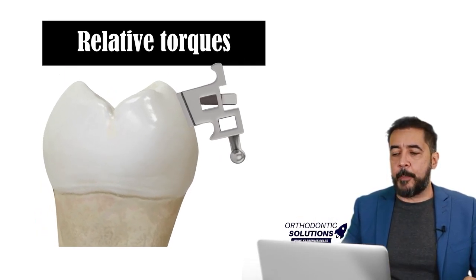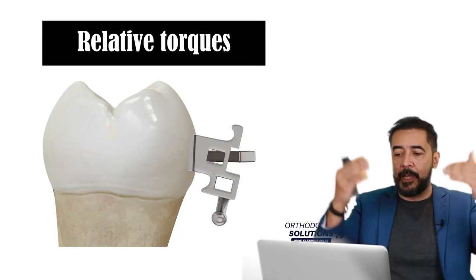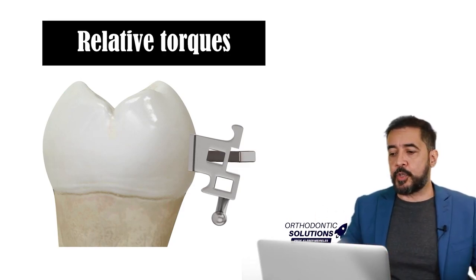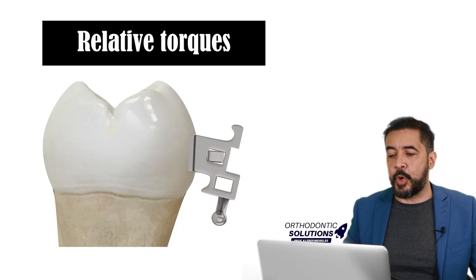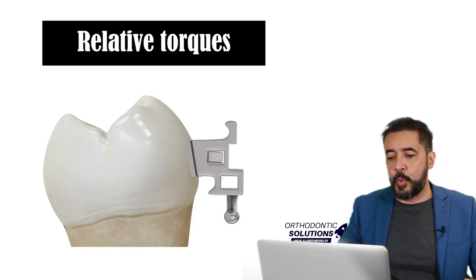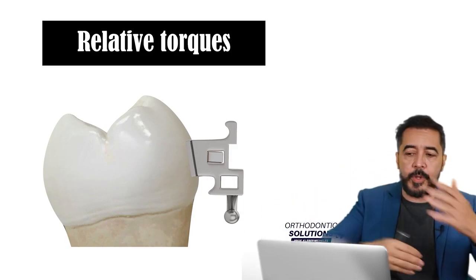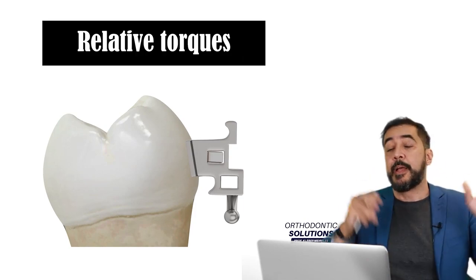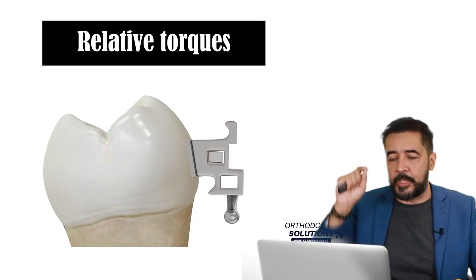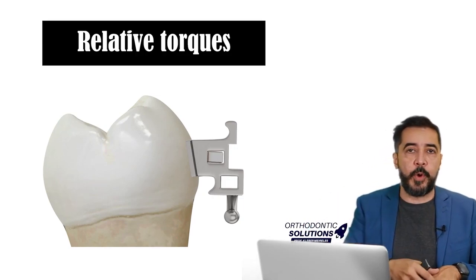And when you do the opposite, when you go downwards, apically, with the positioning of this tube, what is going to happen? Quite the opposite. You get a negative crown torque, meaning the crown goes lingual and the root goes buccally. So when you go to the rectangular wires in our sequence of arch wires, especially the stainless steel rectangular arch wire, we will change the inclination that this tooth is going to read, because we changed the height of the positioning of the bracket or the tube.